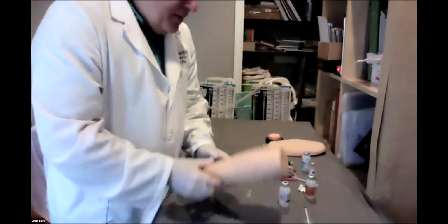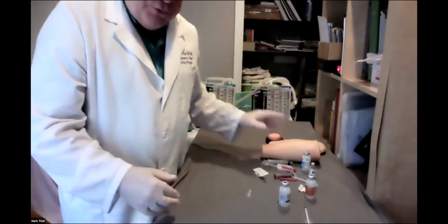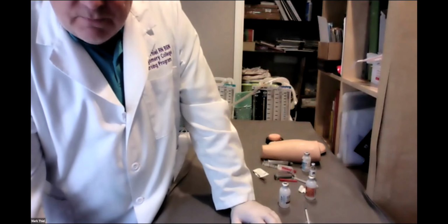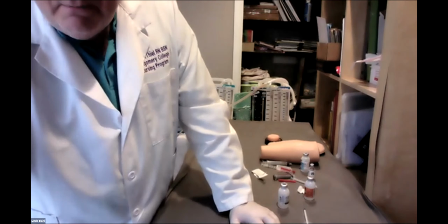Ready? And that is intradermal injection. So, today in our workshop, good to see you back again. Today in our workshop, we reviewed what? All of the safety points and the intramuscular, the subcu, and the intradermal.